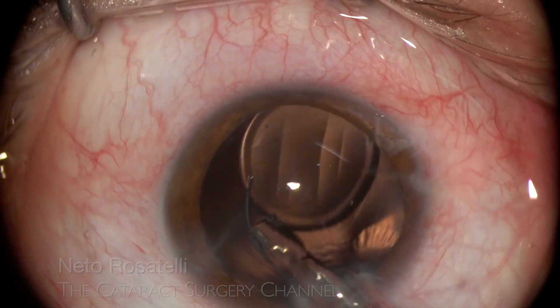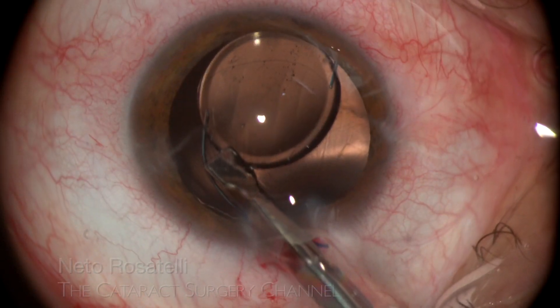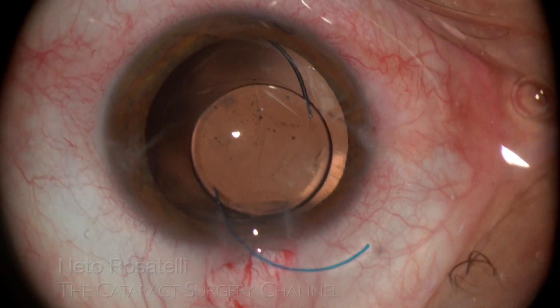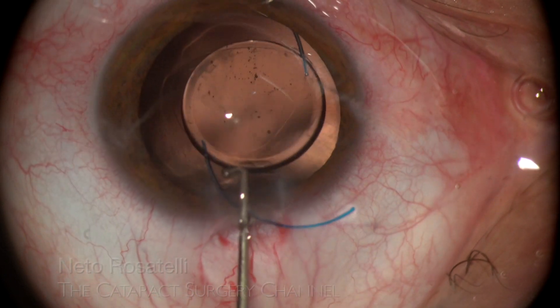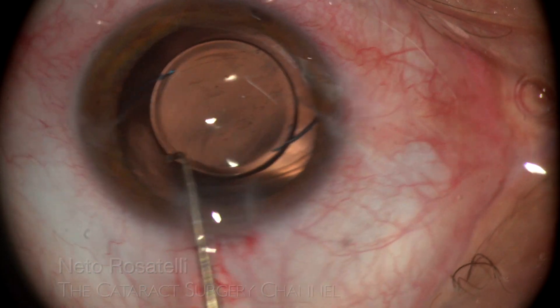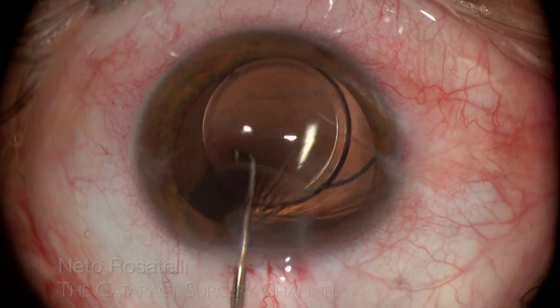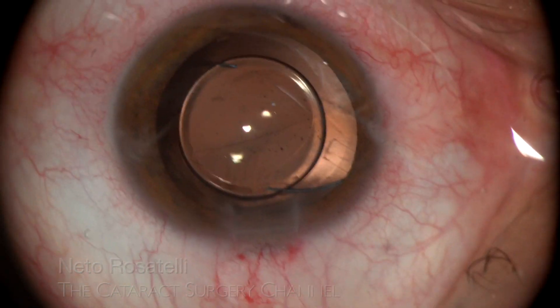This is a rather clumsy injector design when it comes to releasing the trailing haptic. One must be sure the trailing haptic is free before retracting the plunger. Sometimes the trailing haptic can be directly implanted with the plunger itself, but not in this case. The chopper pushes the IOL's armpit in a swift downward dialing movement and the trailing haptic goes in the bag. Walking the line of the rexis, you can confirm the IOL is completely in the bag. The two parallel folds in the posterior capsule are another sign of successful in-the-bag haptic placement.